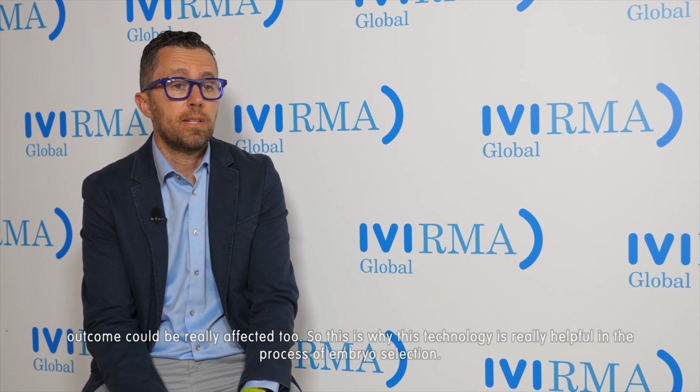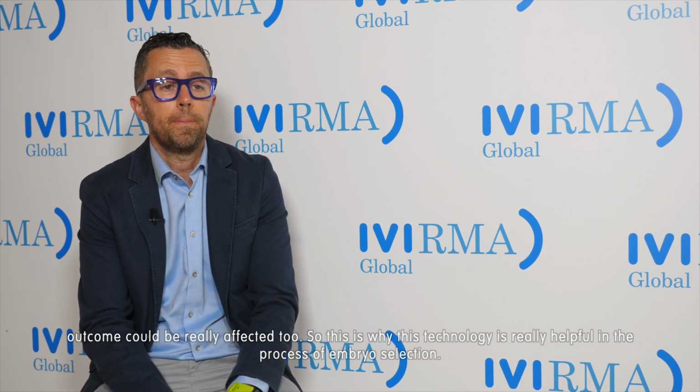We can have a wonderful embryo, a very nice, good quality blastocyst that we freeze, but then after warming the behavior can be affected, and then the outcome could be really affected too. So this is why this technology is really helpful in the process of embryo selection.